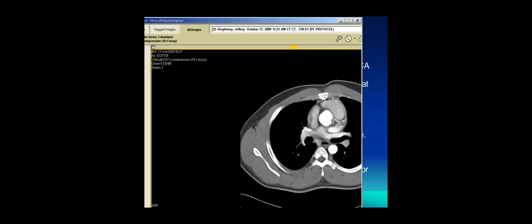Is that a high resolution thing? It is high resolution, but you have to zoom in. You see, this is the left coronary artery, the left anterior descending, and the circumflex. The proximal left main is next to the aorta, and the right is coming out in the normal position. Really, this is not good enough to show anything in particular.